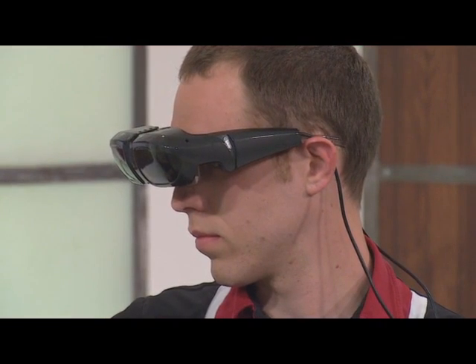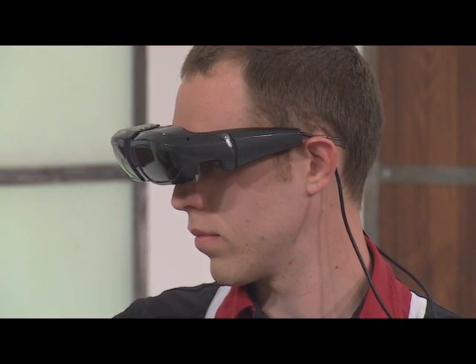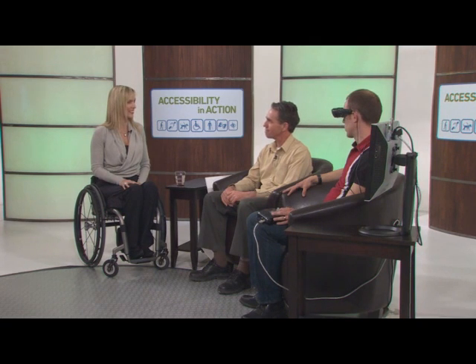Different head mounting options to relieve the weight and make it more comfortable, like a strap at the back, or different types of nose bridges and other things like that. And a little bit more work on the user interface, but the simpler the better is what we found. So these 2 dials are the predominant pieces of the user interface. Really exciting. Opening up a whole new world. It's a great product to work on, honestly.